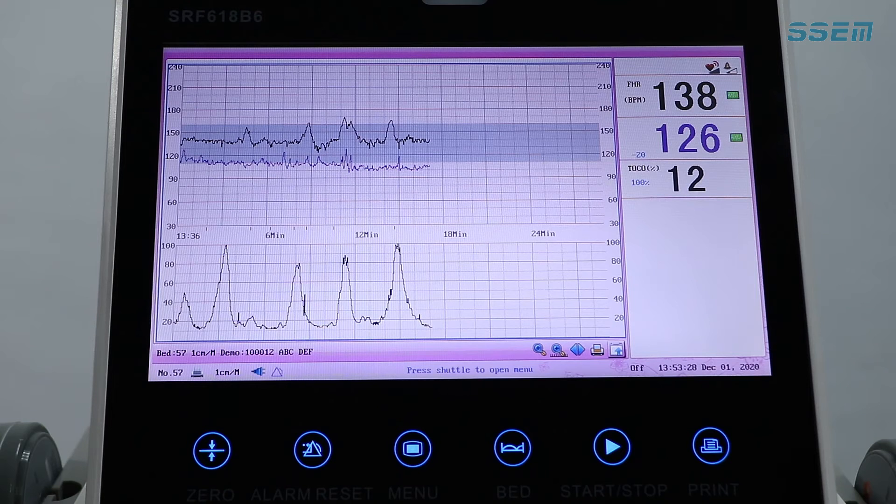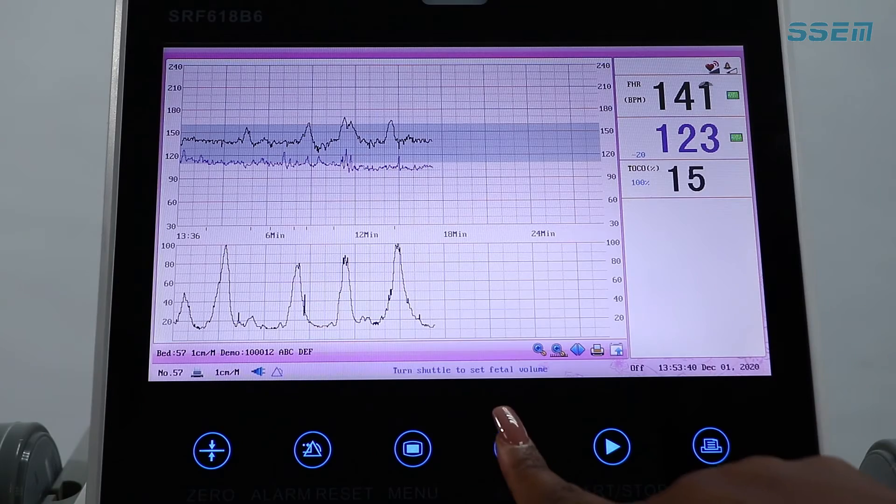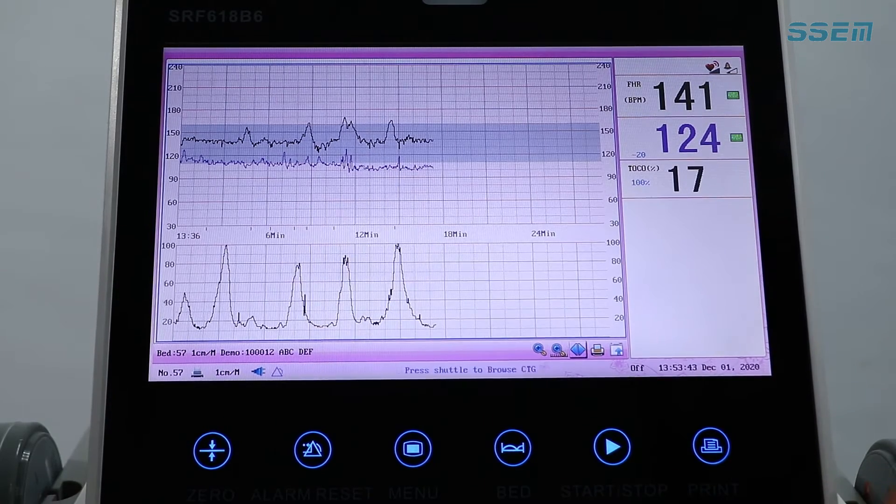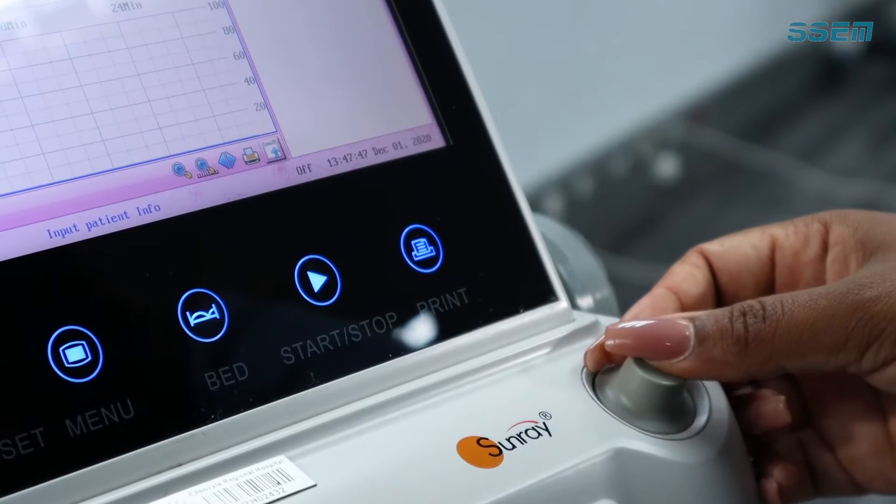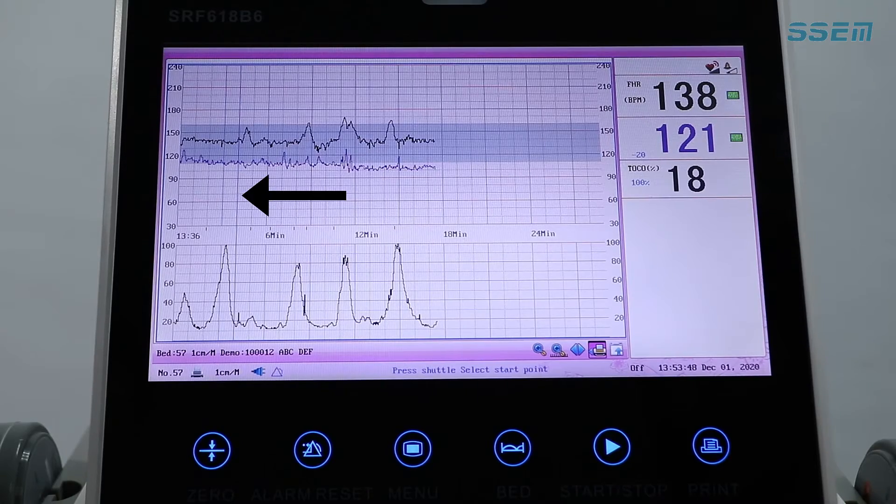Printing. Selected printing or the fast printing method. Press bed to access the display menu. Select the print icon on the inner menu. Push the control knob for a blue line to appear.